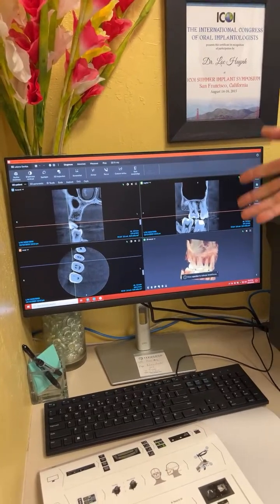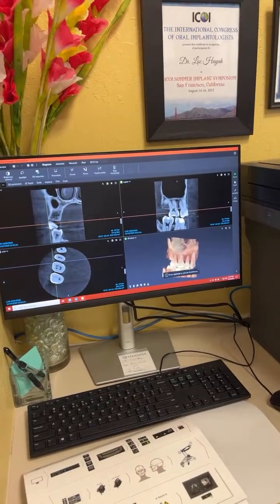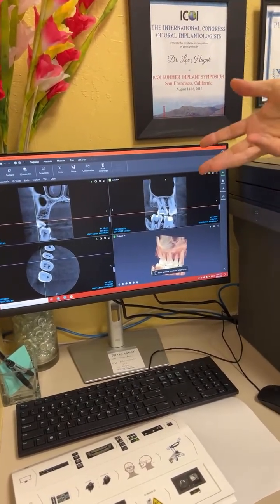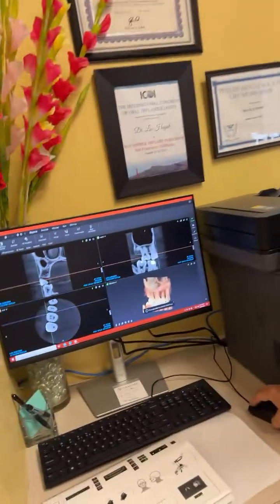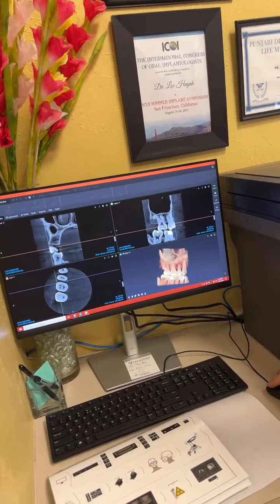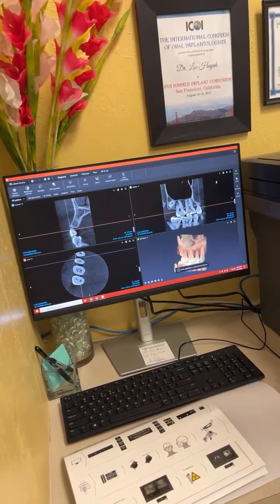Now, this wasn't a great effect because it's the only image in here. But if we had camera images, if we had STL files, anything we've taken that's tagged would pull up. So we selected two. Could you show the same stuff one more time? Hit what? The space bar. And you just hit the number that you want. You said space 4? Watch.